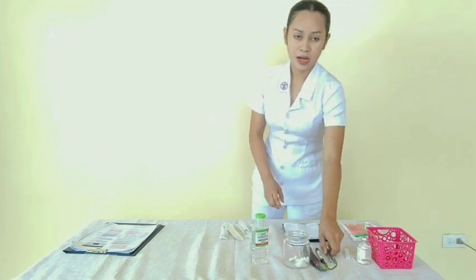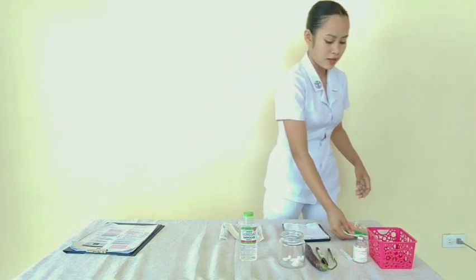And after that we need to prepare the necessary equipment to be used, and this is to conserve time and energy, and this includes syringes, the hypodermic tray, forceps, alcohol, cotton ball soap and 70% alcohol, distilled water which will serve as our medication, an ampoule, a pen, gloves, and a waste receptacle over here.